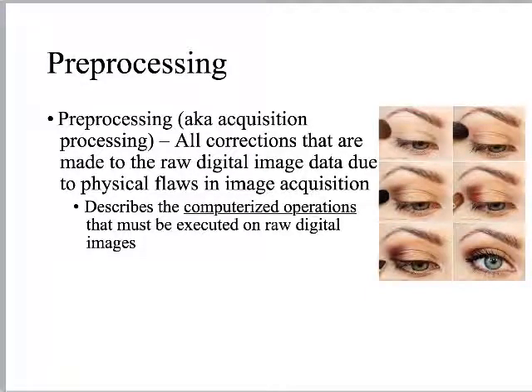And so the important thing here is that these are computerized operations that must be executed on the raw image data. So computerized operations executed on the raw image data, that's what we're going to call pre-processing.